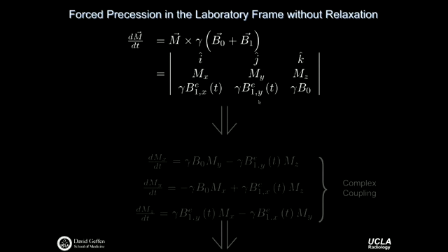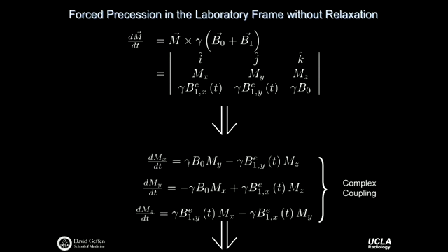And now we have to carry out the determinant operator to figure out what's happening to each of our components of magnetization. And we get something like this. So remember, this time rate of change in the bulk magnetization vector is really three different time derivatives. It's telling us what happens to mx, what happens to my, and what happens to mz. If we look at our determinant up here, I have the I hat direction.